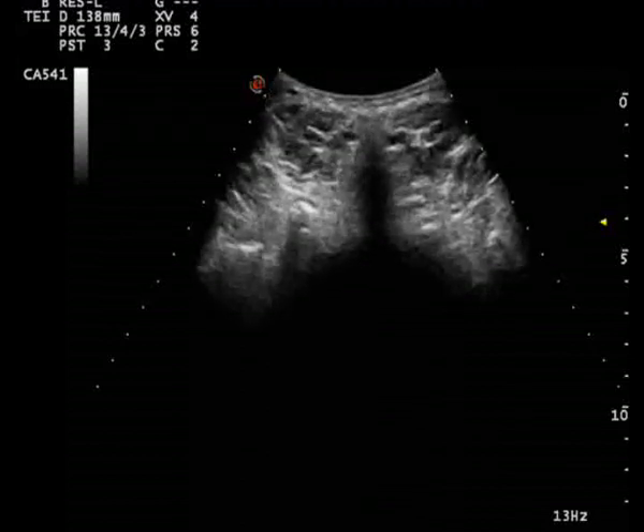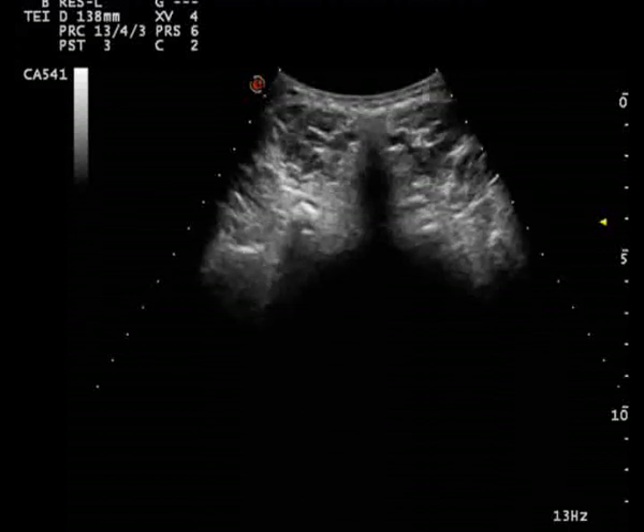The fluid distribution of the injected material can be seen easily on the ultrasound screen.